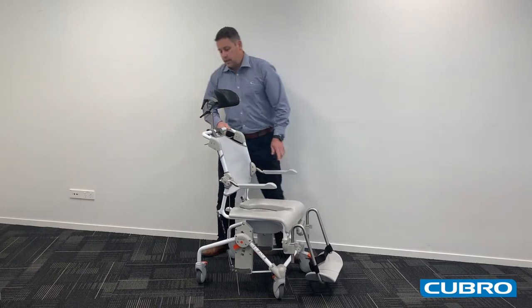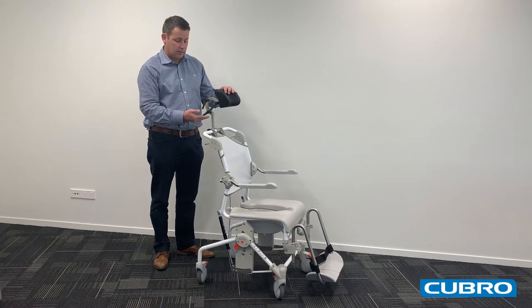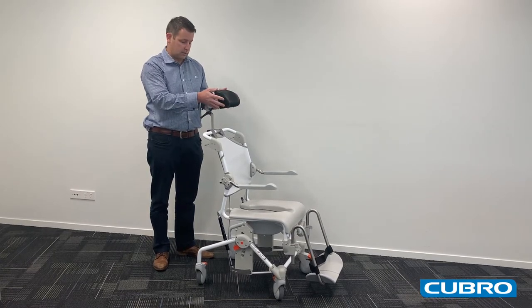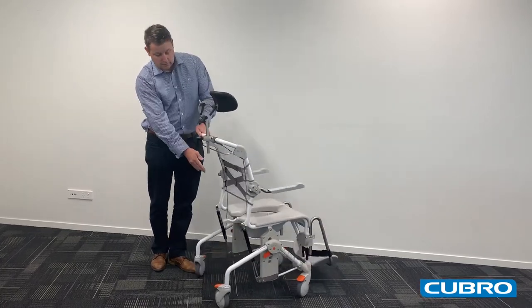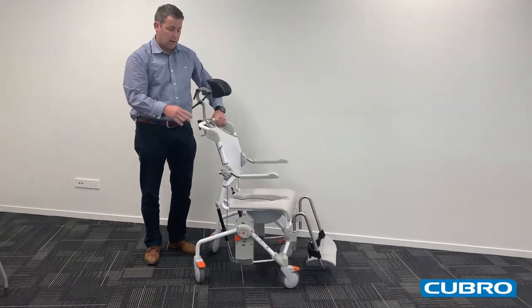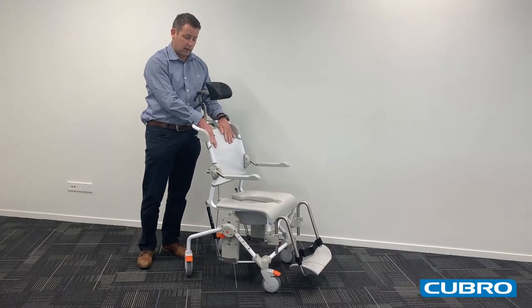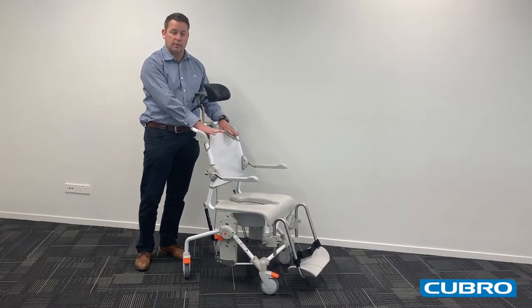The headrest is fully adjustable, with three points for adjustment as well as height, so you can get the headrest in the correct position for the patient. The backrest is fully adjustable with Velcro straps across the back. The material for the backrest is soft, easy to clean, and is also a fast drying material.